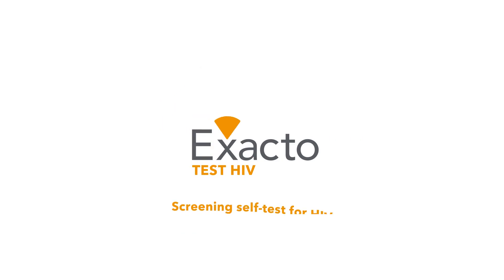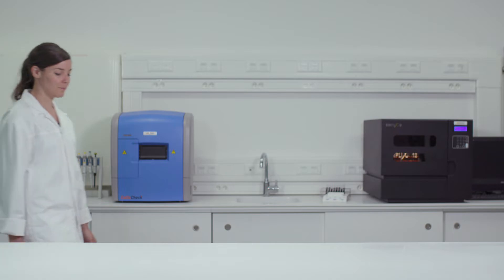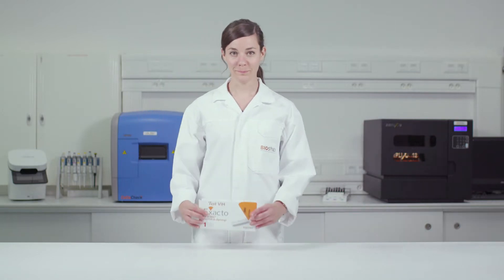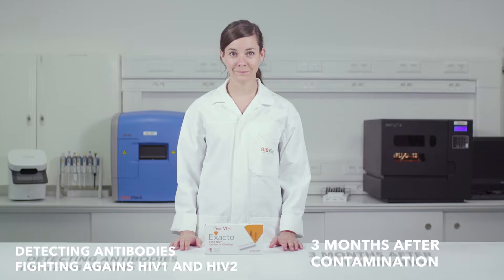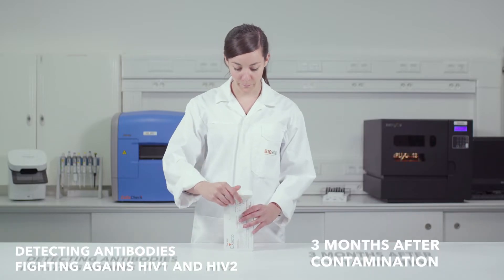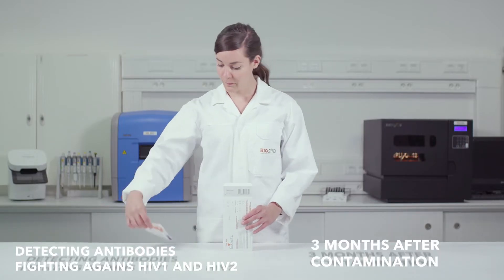Exacto Test HIV is a self-screening test for HIV, the virus responsible for AIDS. This test, with a 99.9% accuracy, consists of antigens and is capable of detecting antibodies fighting against HIV-1 and HIV-2 three months after contamination.